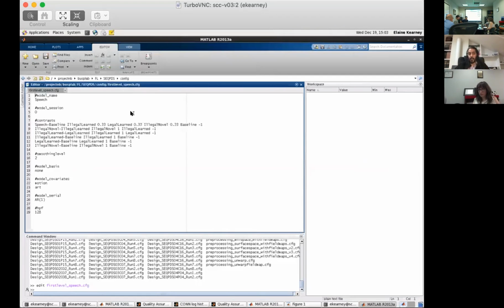If, on the other hand, you do have numbers that are like time series, for example, you might have recorded a lung volume, or heart rate, a continuous time series that represents the actual heart rate, and you want to control for potential covariation of the BOLD signal activation with those time series, then those are also covariates, but they are temporal covariates, and you can add them here where it says model covariates, where you can add individual files that contain this type of time series. That basically is anything that is a time series, one number per scan, per acquisition.